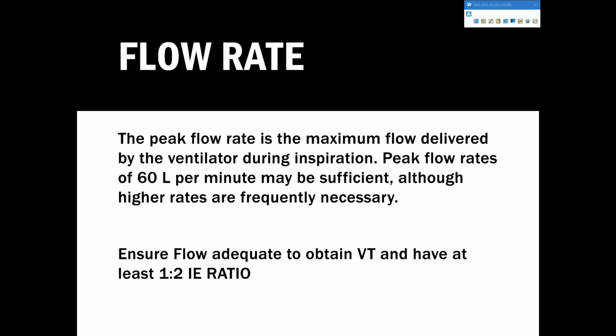All right, peak flow. So in volume control, your peak flow is not only important for your patient to be able to get the tidal volume, breathe comfortably, not air starve, all of those things, but it's also what is allowing you to have a normal IE ratio. Your peak flow is what's giving you your IE ratio, and you always want to have at least a 2 on the expiratory side of the IE ratio. So it's a ratio. So 1 is going to be the first part until we go to reverse, but that's a whole other world. So you want it to be 1 to 2.